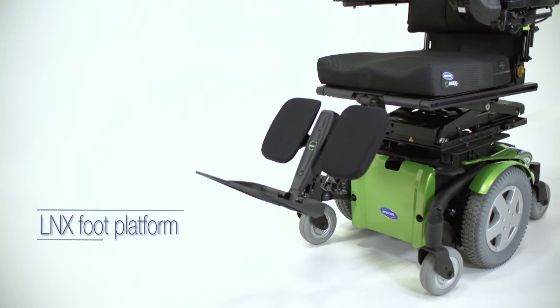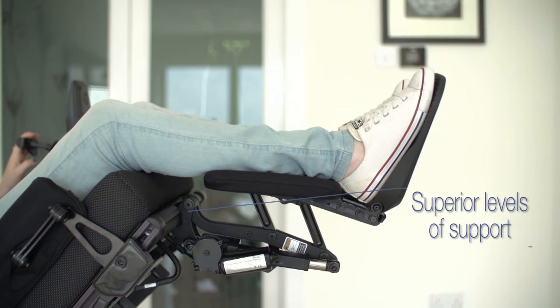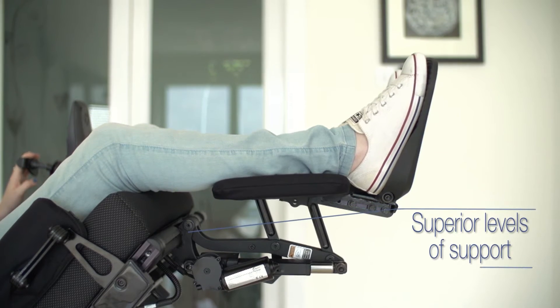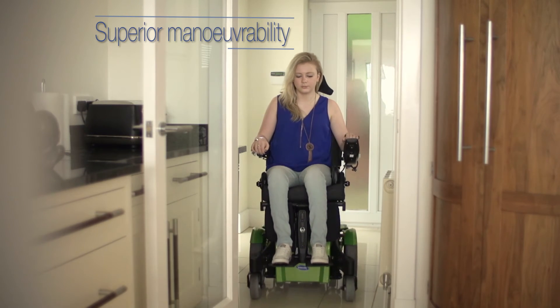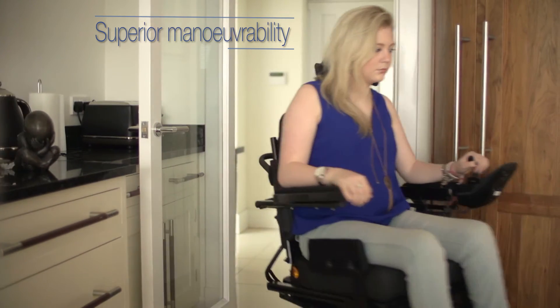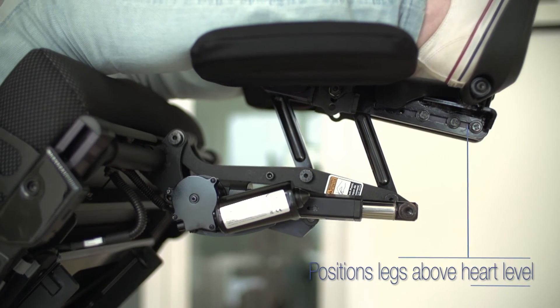The LNX Power Centre Mount Foot Platform provides a superior level of support to an individual's legs and calves throughout the entire tilt and recline cycle, while reducing the turning radius and giving individuals greater manoeuvrability, offering a more efficient midline support ideal for positioning legs above heart level for individuals with lower extremity oedema.